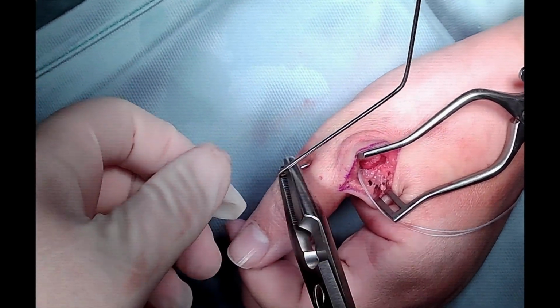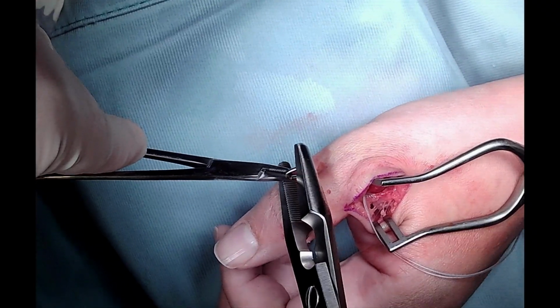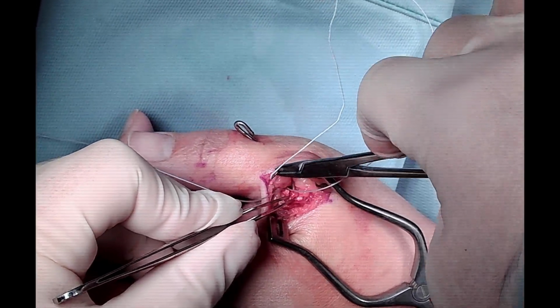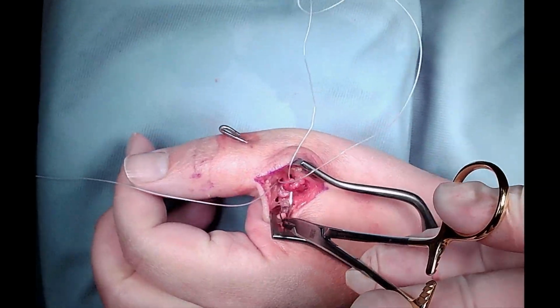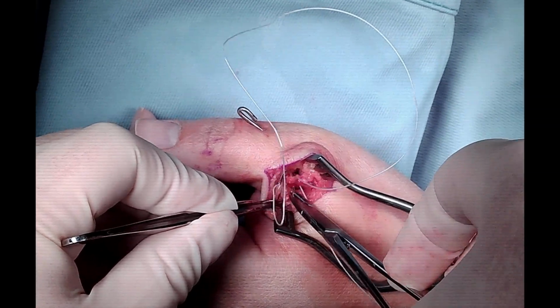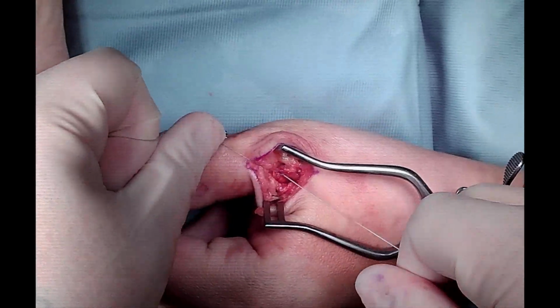Following this, we put a pin in the MP joint in order to protect our later repair. This is instead of putting a cast, so we will not put a cast. Eventually this pin will help us make sure that our repair that we are doing right now with the help of these 2 FiberWire sutures is safe, and we keep it for 3 weeks.